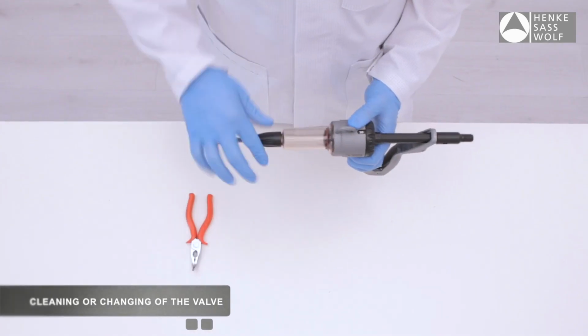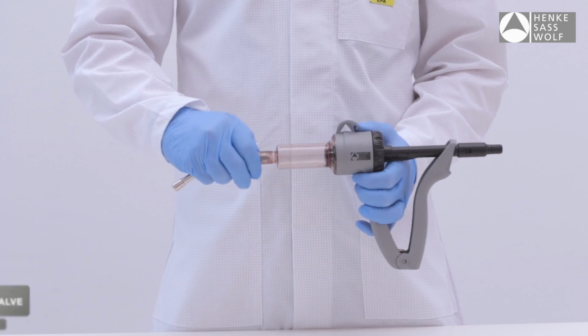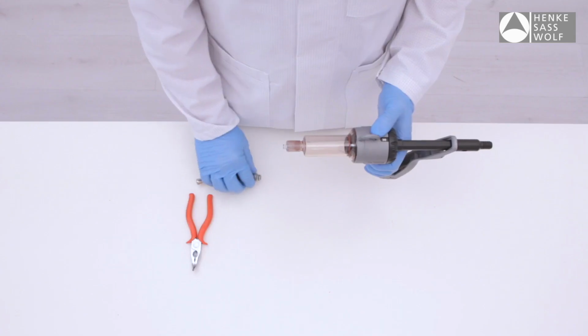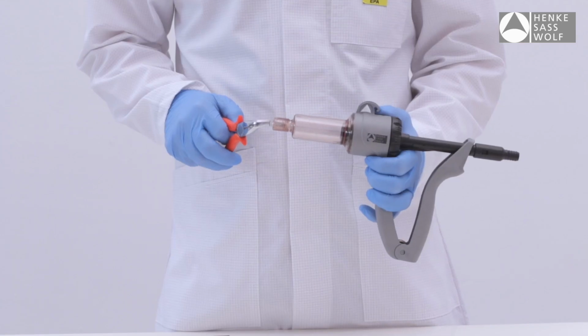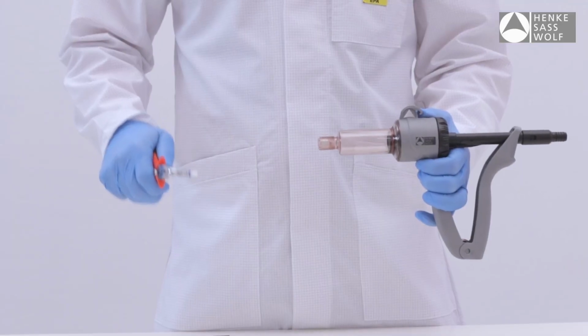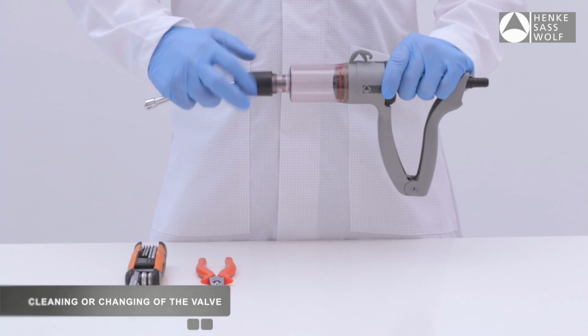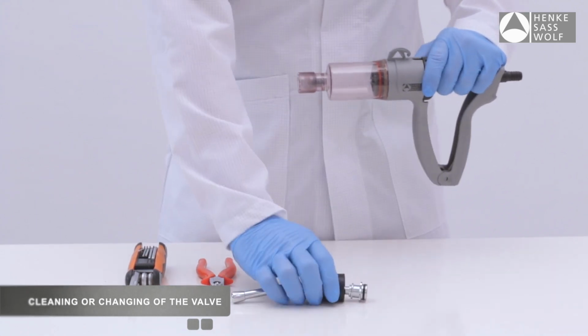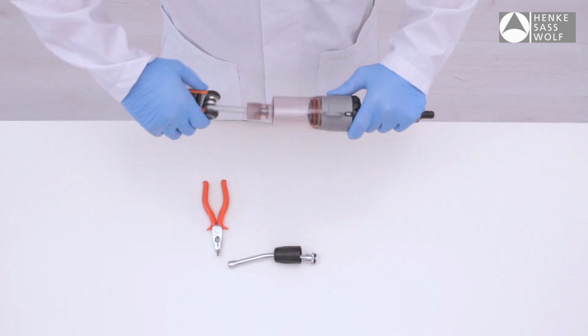Remove the cap nut from the cylinder by rotating. For HSW Eco Matic Drencher with 12.5 milliliters and 30 milliliters volume, take off the valve with spring and O-ring ahead against a little resistance. Do not pull at the spring. For HSW Eco Matic with 70 milliliters volume, take out the valve with spring and O-ring by screwing out the valve screw at the front end of the barrel.